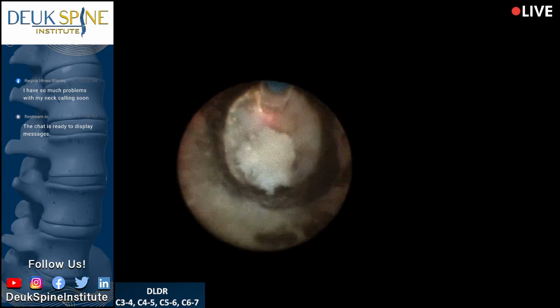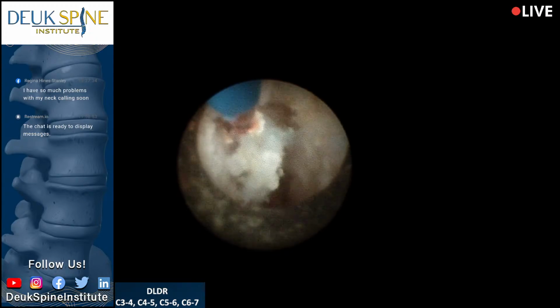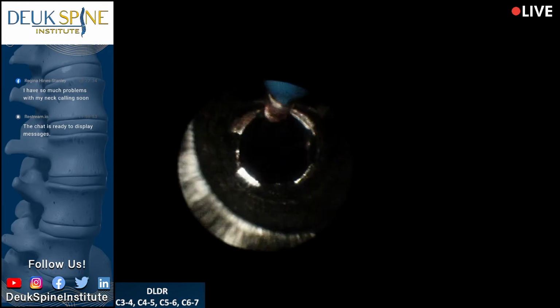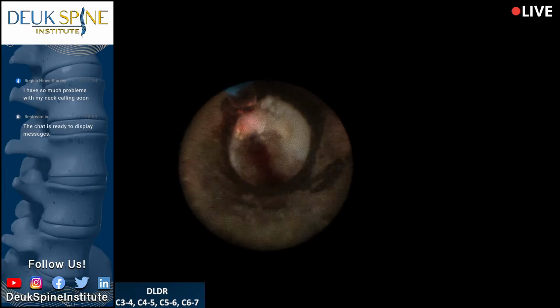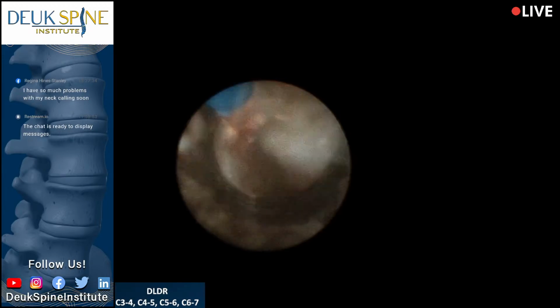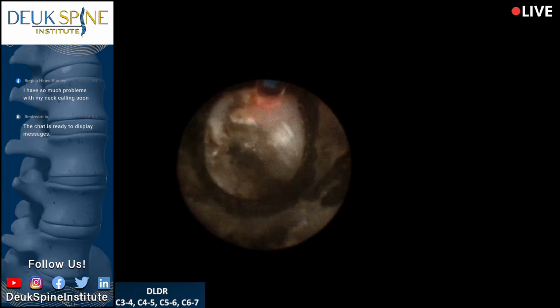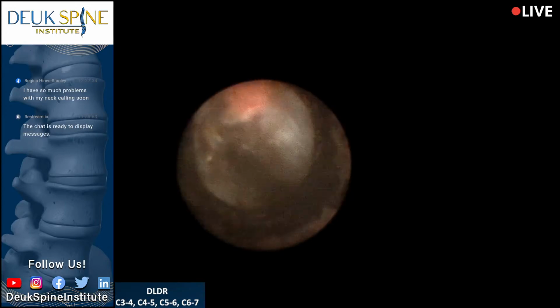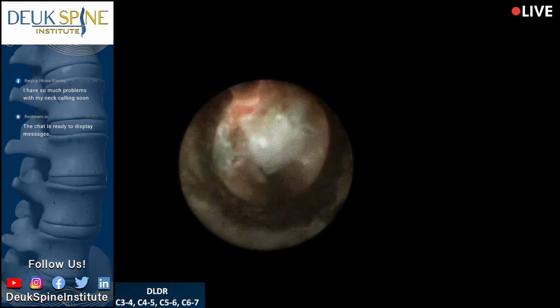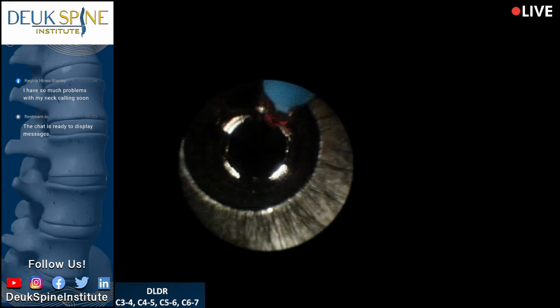There's all scar tissue here, calcified fragments of herniated disc. These are all herniated disc fragments. They're very calcified, very, very hard. They're like little pebbles. Okay? Totally abnormal. That's the foramen below me. And this is the source of a lot of his pain. Oh, just herniation after herniation coming out from this one disc.